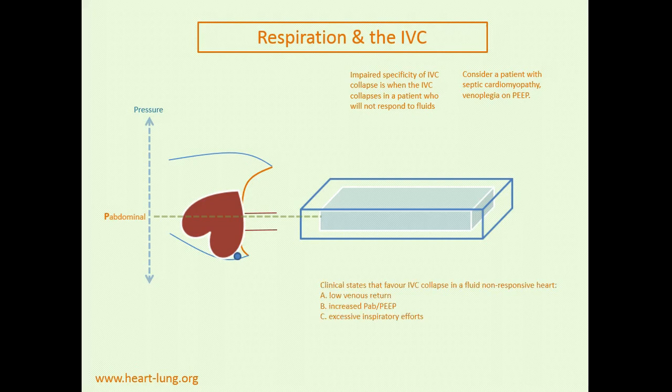So this will impair your specificity. It will give you a false positive. You'll see the IVC collapse, you'll say, oh, hey, this patient will respond to fluids, I'm going to give them a challenge, but they actually won't.